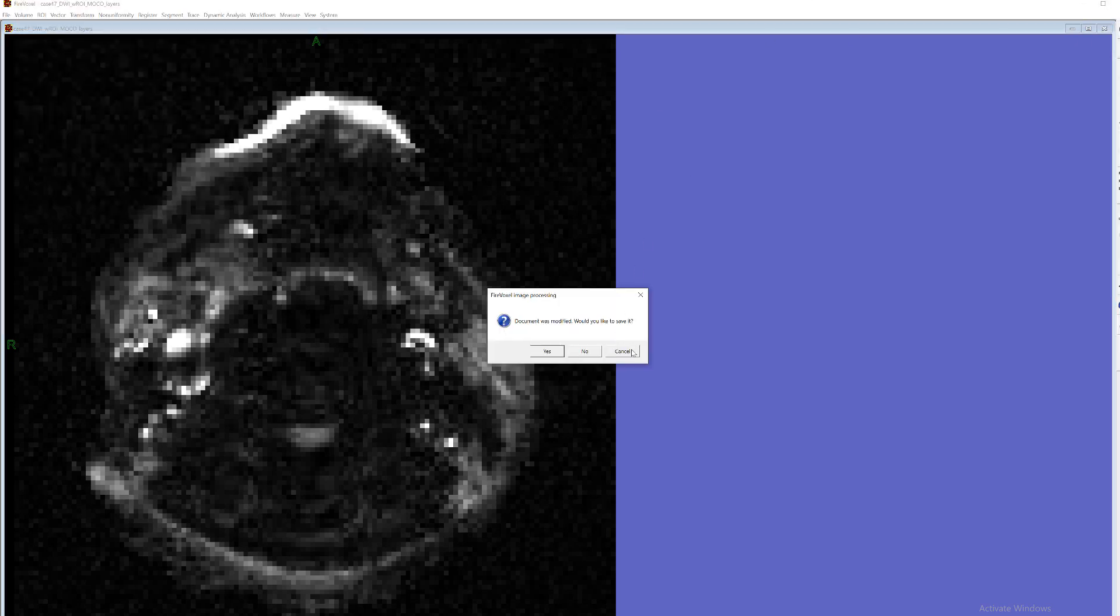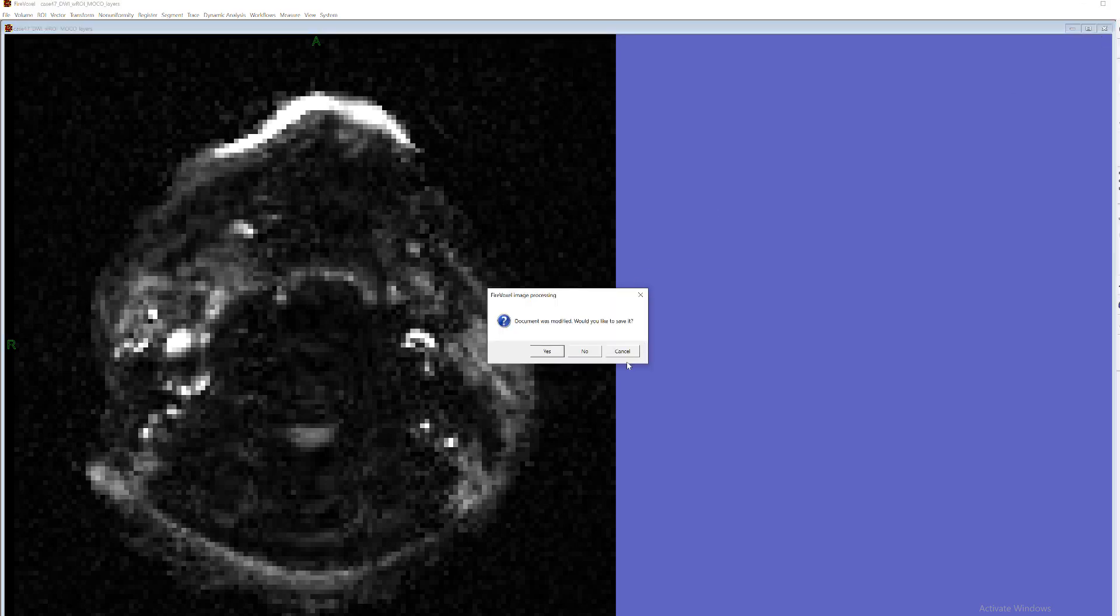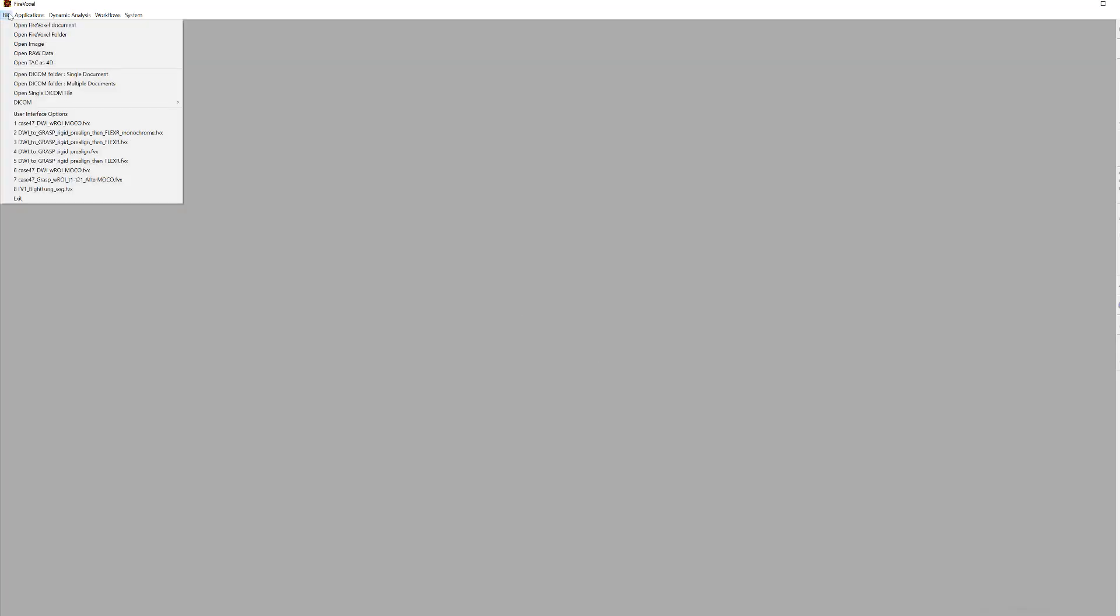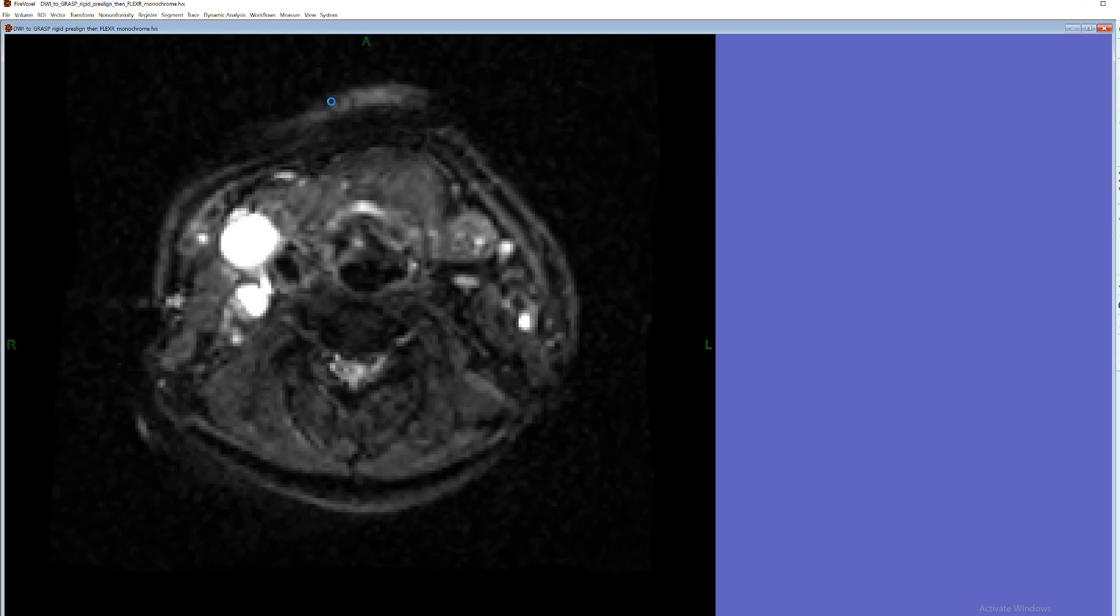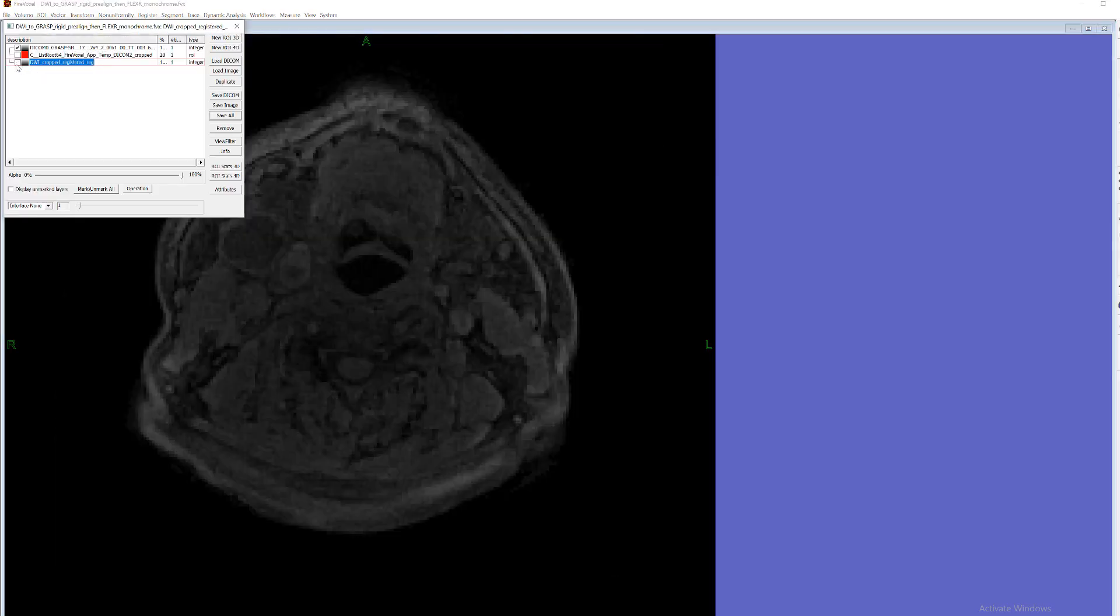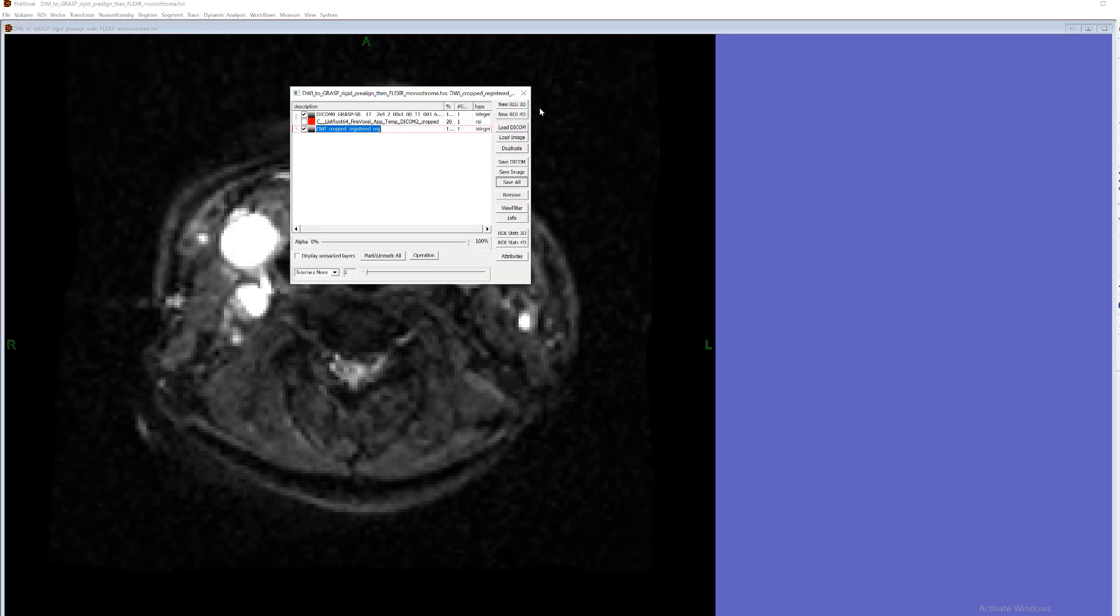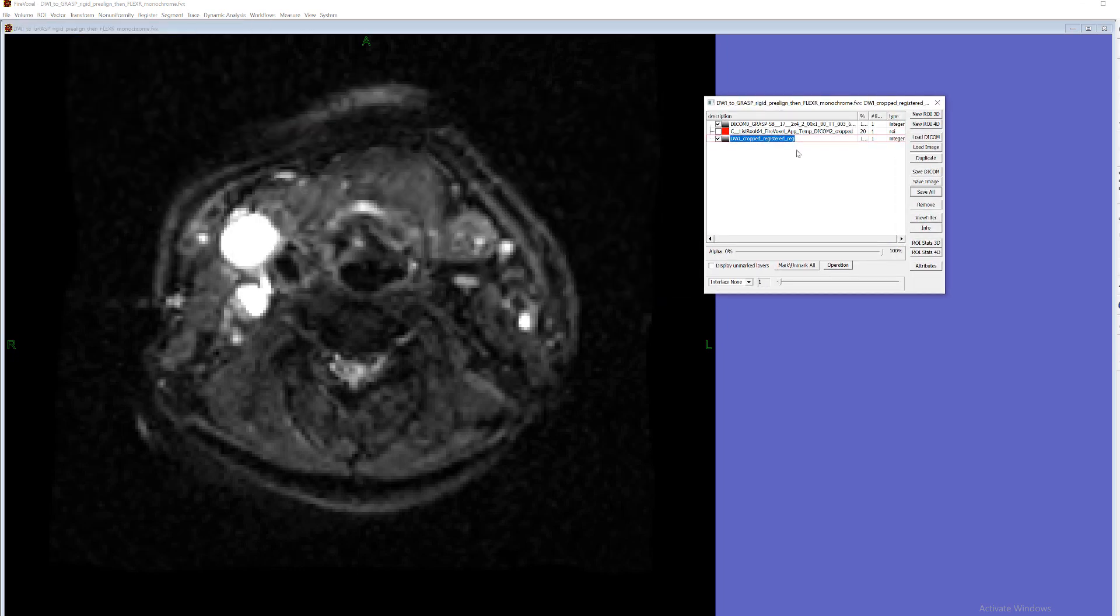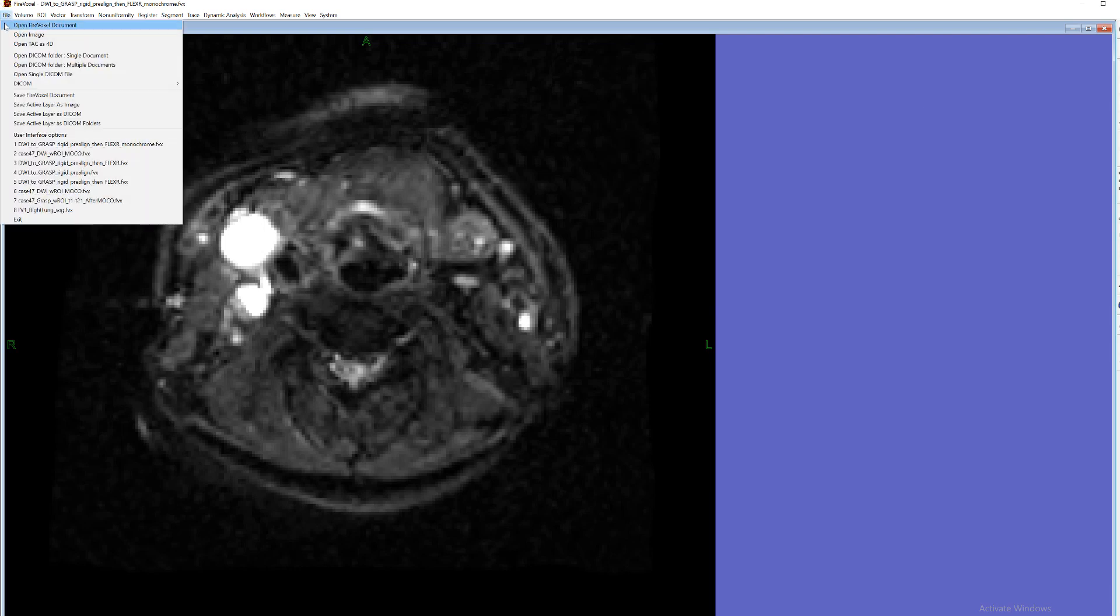Okay so that was feature number two. Now the third feature is for checking precision of the registration. So in this example this was Grasp DWI registration. There are two layers.